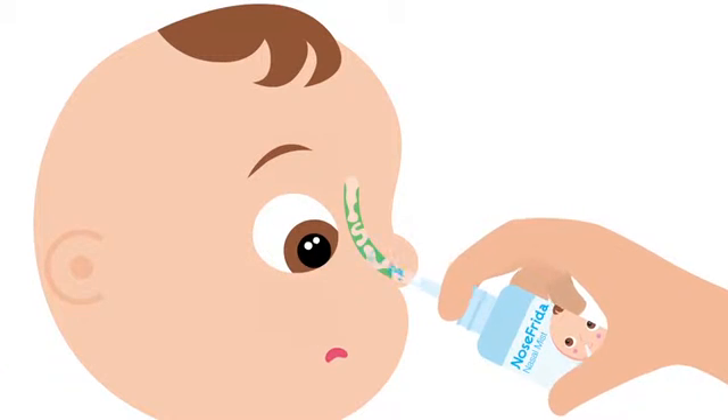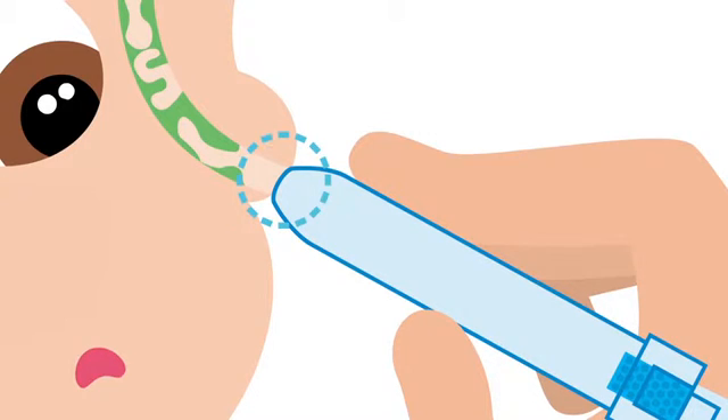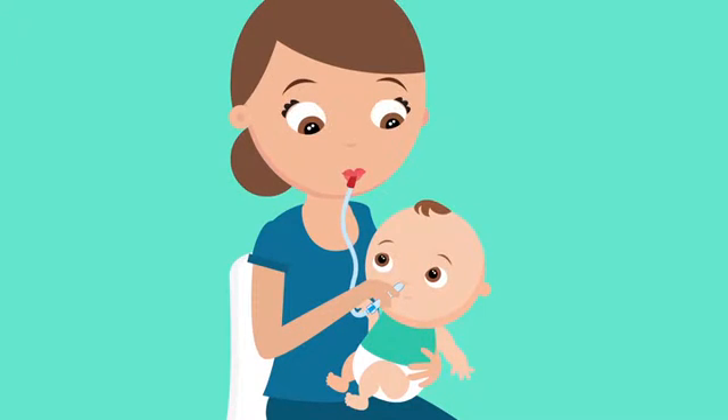First, soften those stubborn boogies with a natural saline mist. Then, simply place the tube to form a seal with the outside of baby's nose, and suck away the snot.